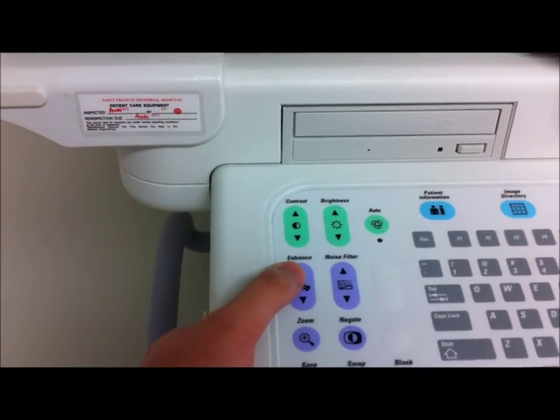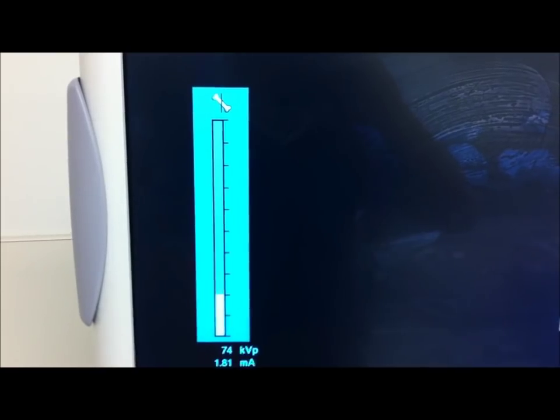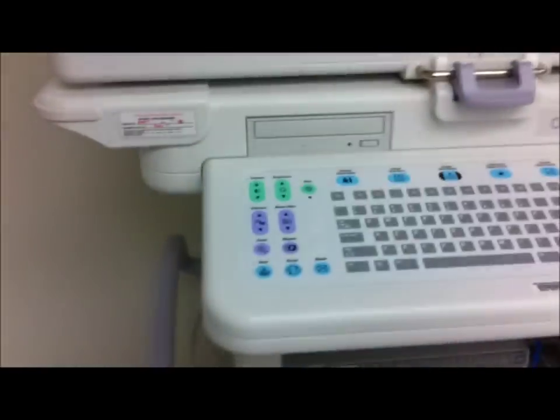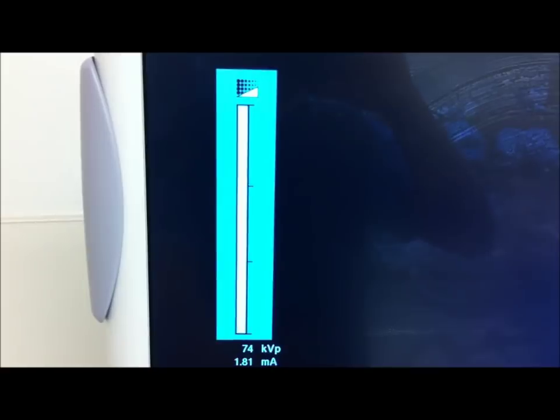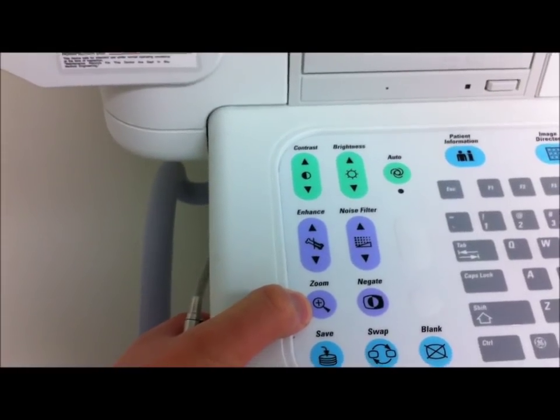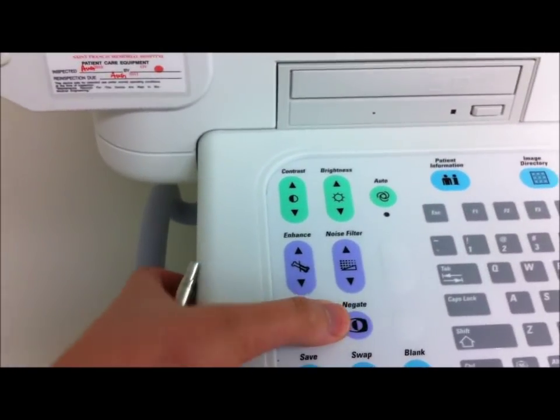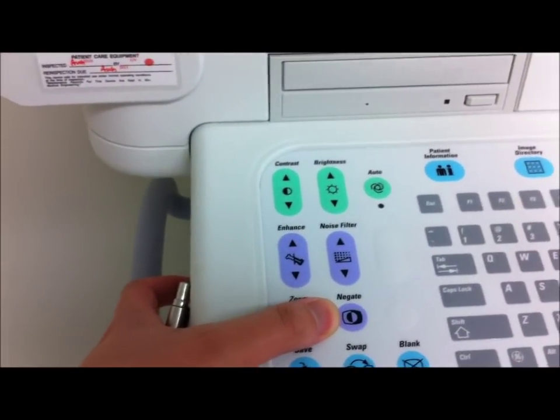Over here you have image enhancement — it is a sharpening filter, so you can raise it up as high as you want or as low as you want. This here is the noise filter, which can reduce noise during fluoroscopy. It does not actually remove noise during a still image or a last image hold. This is the zoom button — pretty self-explanatory. And negate means to invert the image, so from your usual black and white to white and black.